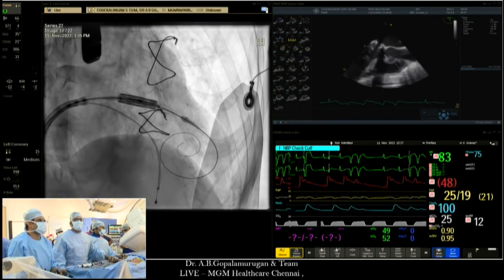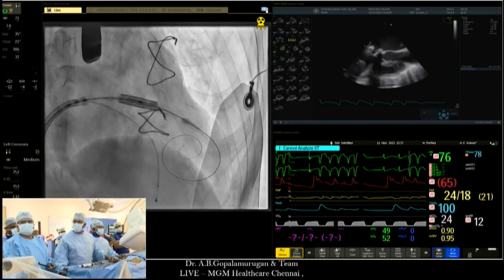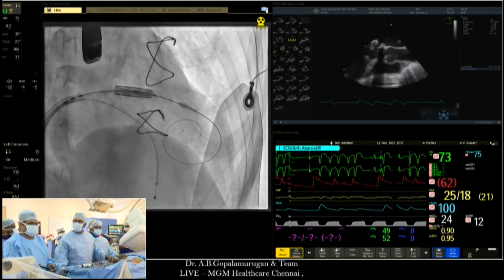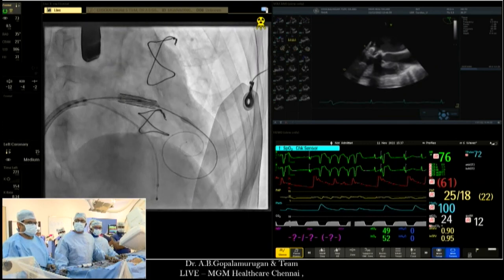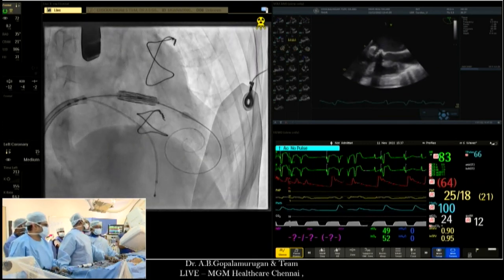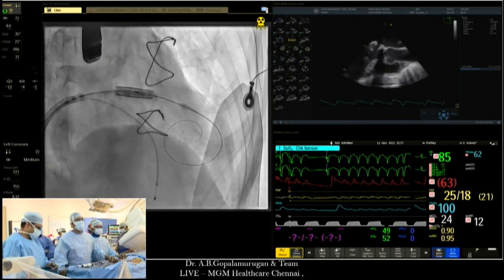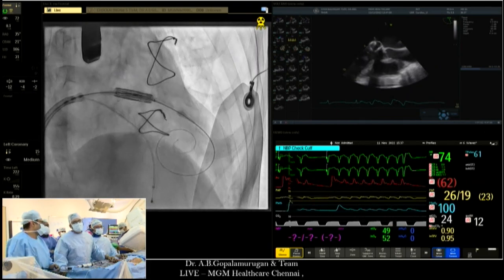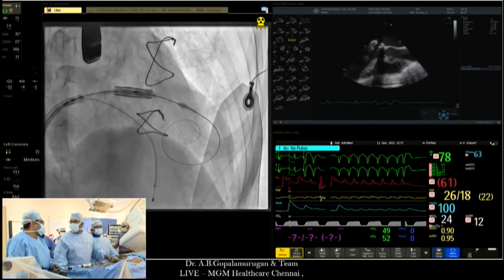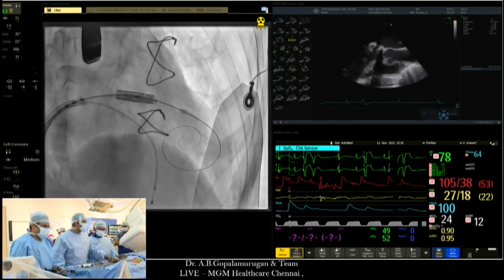Okay. Pacing on. We're going to pace at 180 maximum output. Nobody else talking. Breathing off. Abu, you're going to go very, very slow and all the way. We maybe will do a double inflation. I'll tell you when. Don't stop until we tell you. Okay? Ready for CPR?